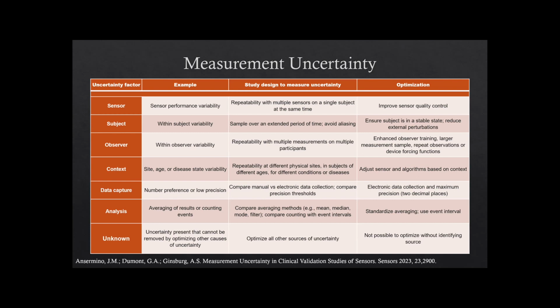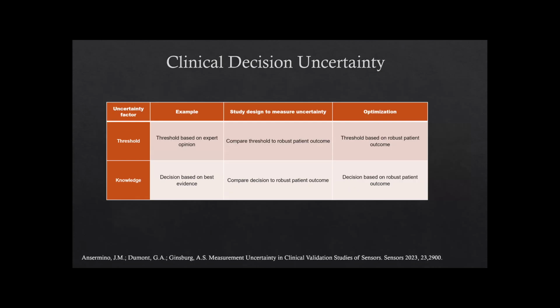But there's another whole concept of this, and I know that Sandy did address this earlier, which is really clinical uncertainty. I think we should not forget about this, because it is really important. Certainly in the context that I work in, which is really around guidance put out by the WHO and others, there's a lack of understanding, when using thresholds to provide guidance around the use of things like pulse oximetry, that there's a lot of uncertainty in how we actually do this.